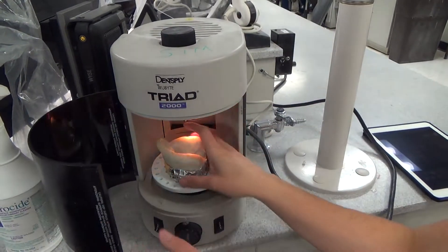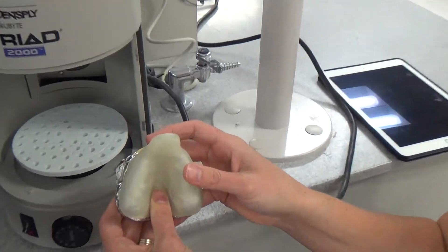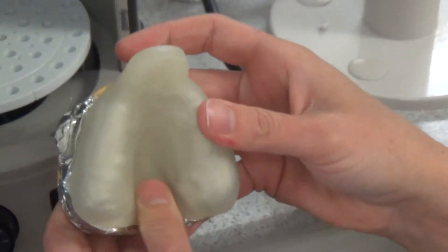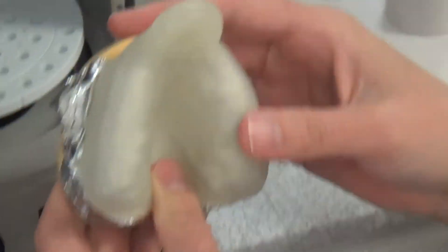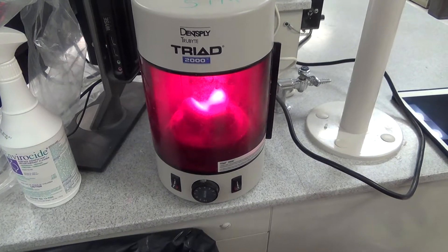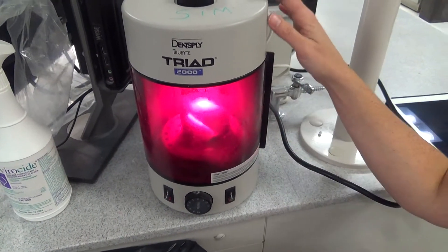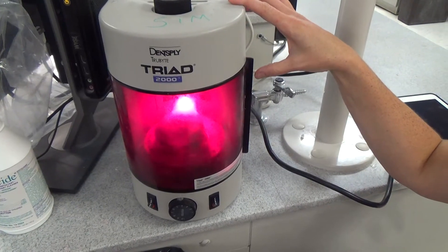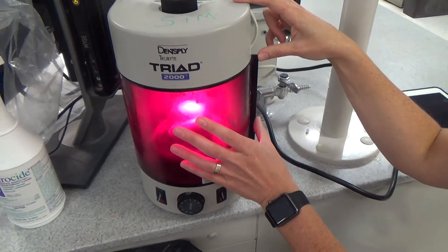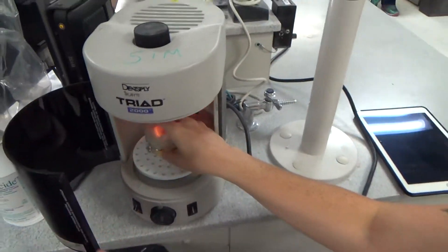I'm going to take it out and re-adapt the palatal area. You'll be able to see this on the demo when I upload it. I'm just going to push into the palate and do it again. This is really more important when you're doing a record base, which we're going to talk about in a couple of weeks, because the record bases are what are going to help hold all of the wax and the teeth that you're trying into your patient's mouth. Do another 15 seconds.